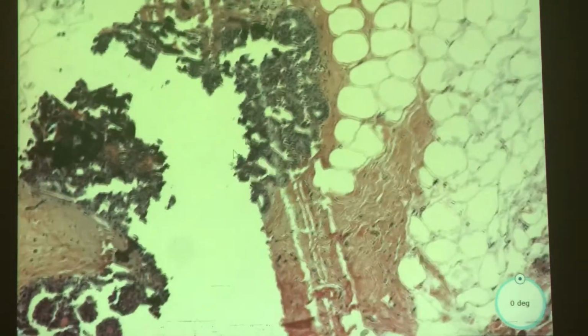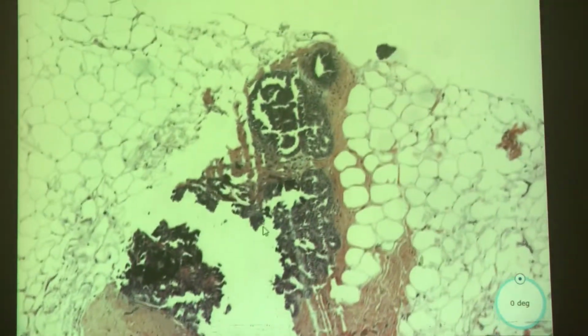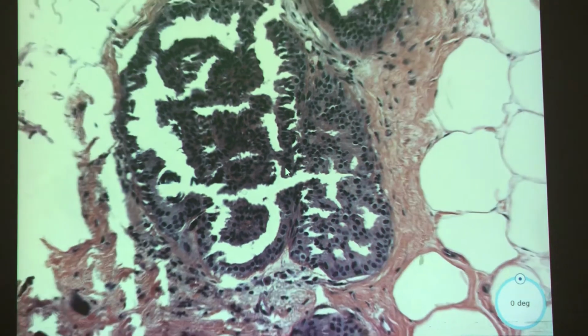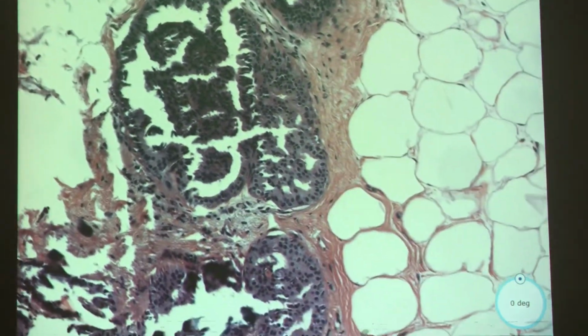Alright. More breast tissue. There's some ducts up here, a little power. This looks like more just fibrous tissue. So I'm going to start here and see what we find. Excellent. Okay. So we don't have much to work with here. Not a lot. But let's see now.